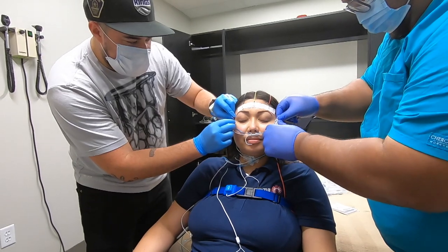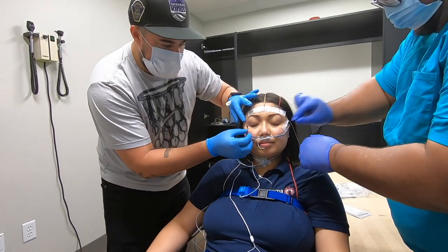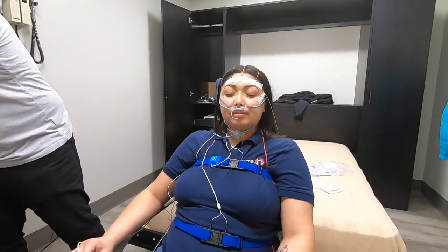Eye electrodes are going on now. One should actually be lower and one higher — they're doing it wrong but we don't really care, it's just for signals. This can tell us if you're looking up, down, left, or right. It helps with REM sleep onset.